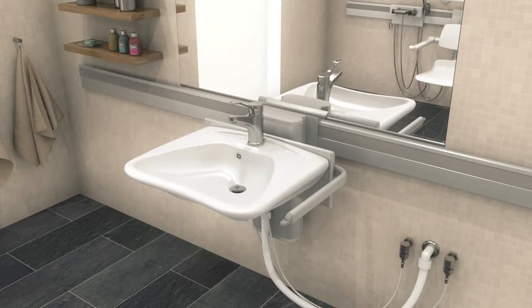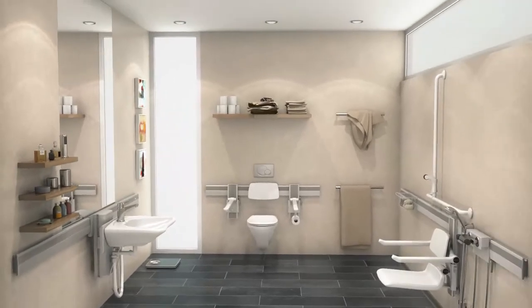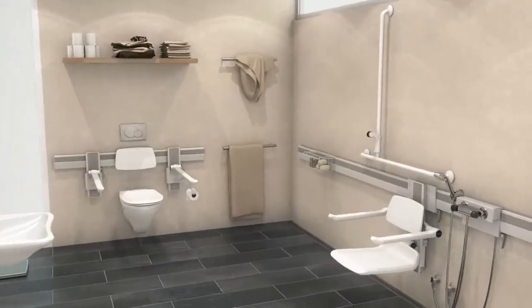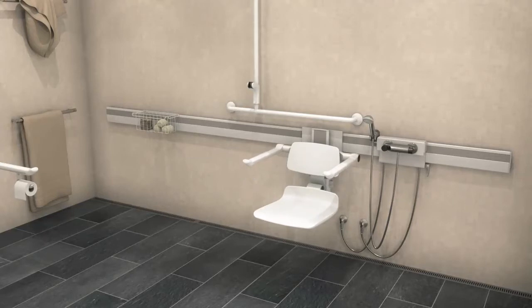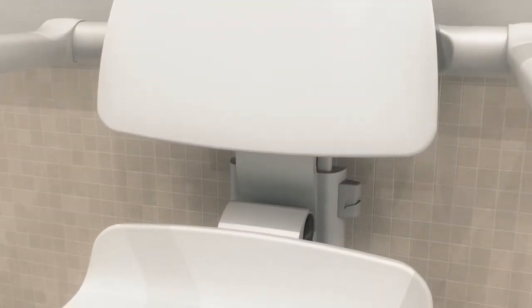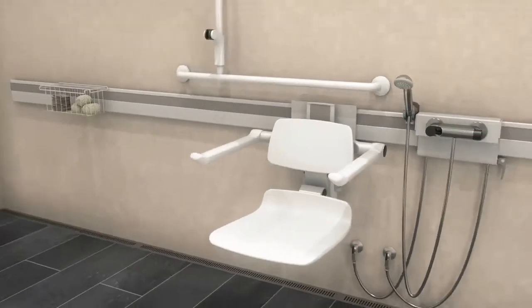Our goal is to create flexible surroundings that will suit anyone. The beautifully designed shower seat from the Press-A-Lit Care Plus series has a tall backrest, which ensures the user feels comfortable and safe in the shower. The seat, back and armrests are height adjustable, ensuring that they can always be set to meet the individual's needs.